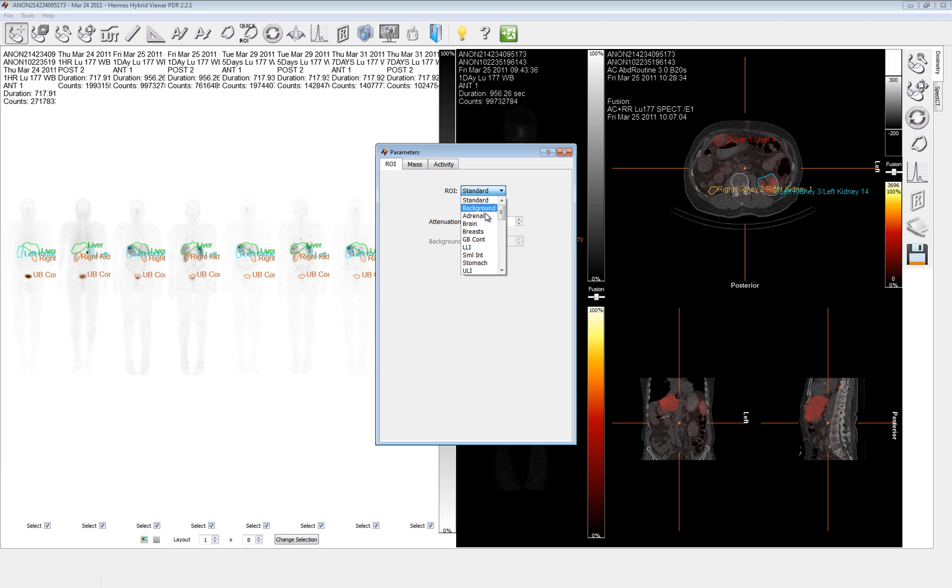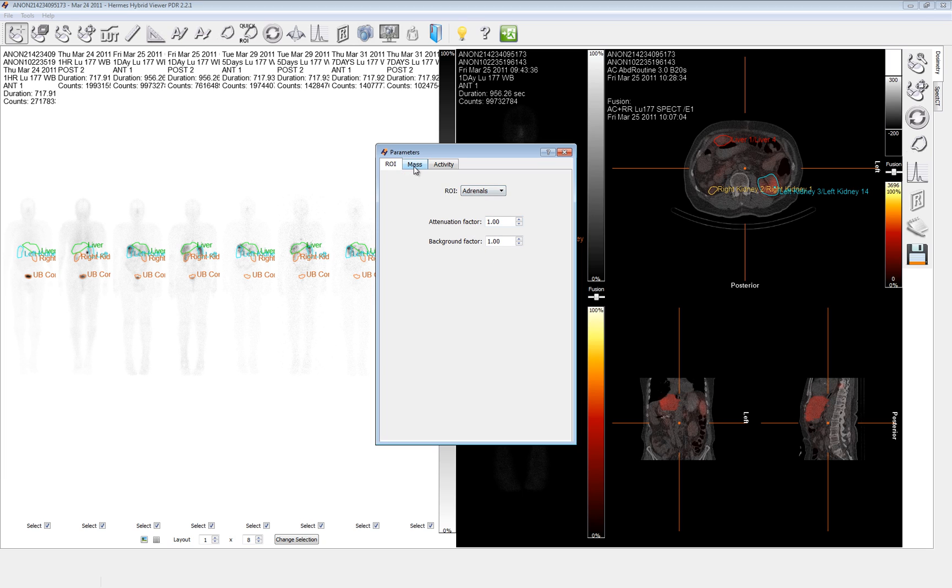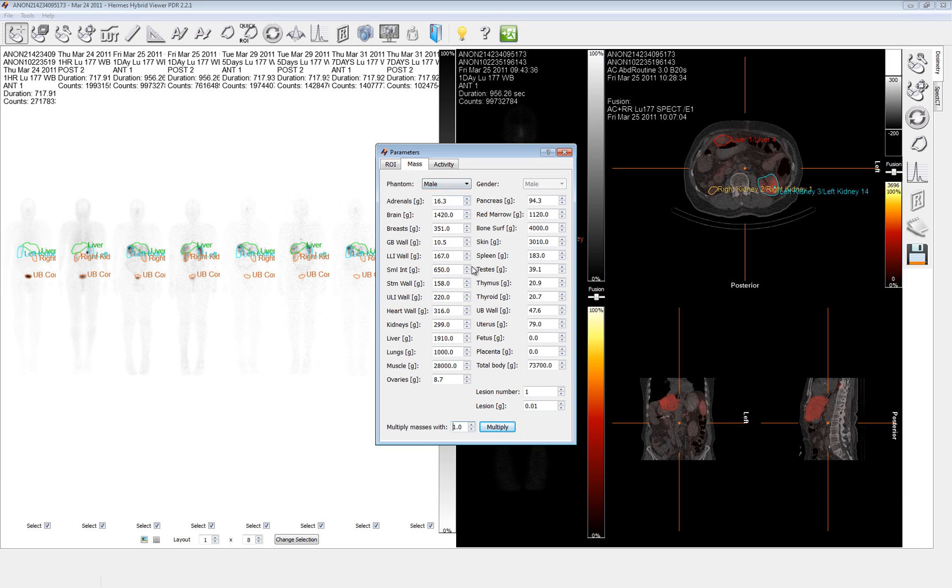We can take all of the ROIs that we've potentially drawn and give them an attenuation factor and for some of them that are not the standard, even a background factor. This is all ways to compensate for the fact that a two dimensional whole body scan is nowhere near as complete of information as the SPECT CT is for being able to do attenuation corrections and the actual amount of body thickness that those are covered in.